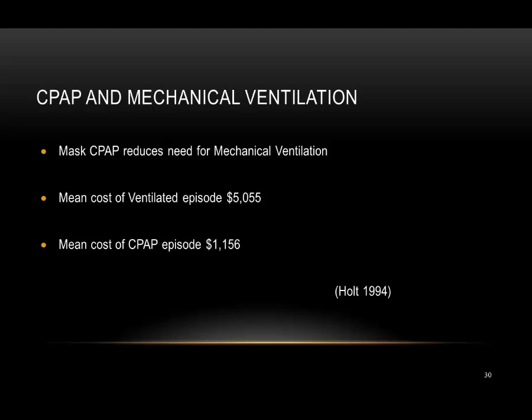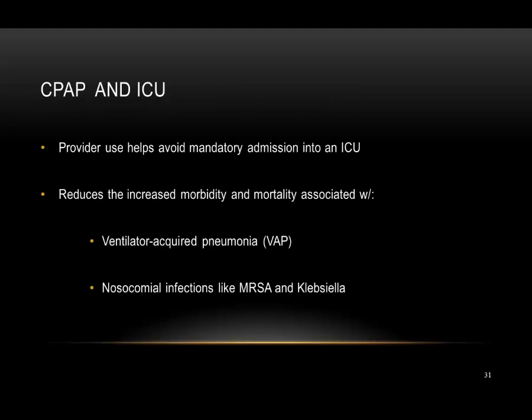Not only is there a cost saving, but in critically ill patients that you have to paralyze and intubate, that minute or so of decreased ventilation and then apnea while you do the intubation and tube check may be lethal. In addition, intubated patients can have complications such as great difficulty weaning from the mechanical ventilator. Using CPAP can help avoid mandatory admission into the ICU and reduces the increased morbidity and mortality associated with ventilator-acquired pneumonia and nosocomial infections like MRSA, which are rapidly becoming antibiotic resistant.